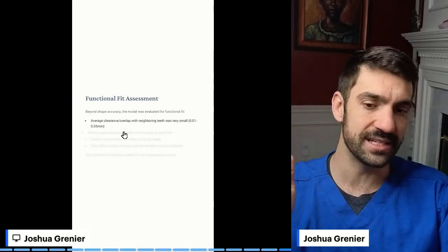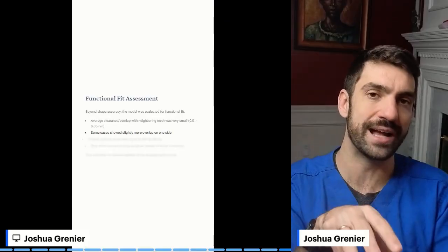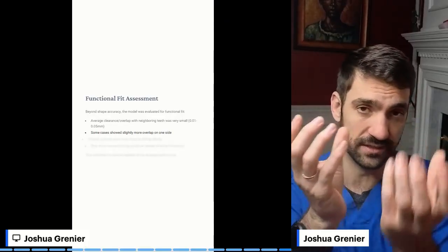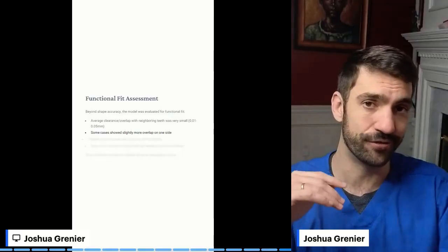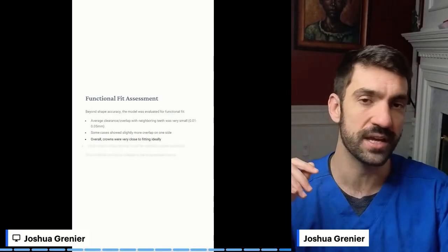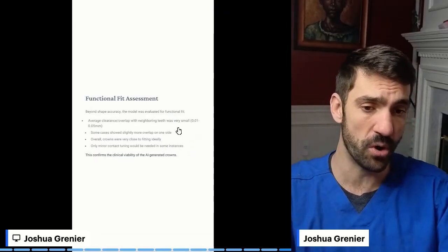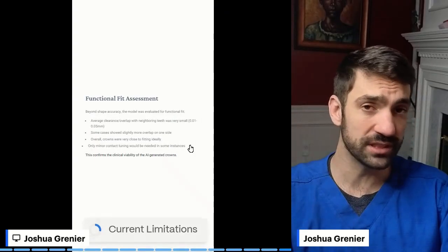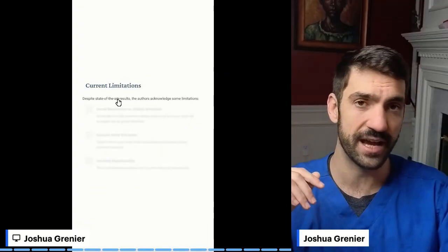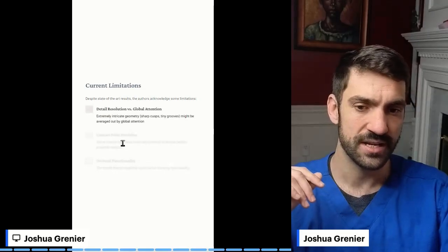And the interesting thing is these didn't necessarily use the more traditional methods where you're using a subtractive technique, where you maybe build up the top of the crown generatively and then subtract it onto a virtual digital die. This works a little different. This creates the whole thing, and it works fairly well. They claimed they had fairly small overlap, which is really very impressive given the amount of data they were able to actually put in and the limited customization they really did on these models.